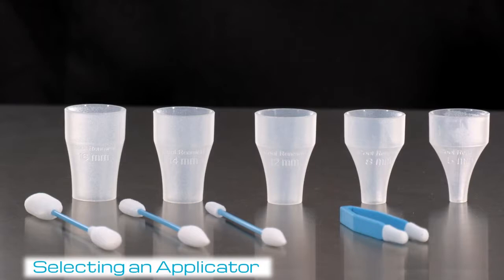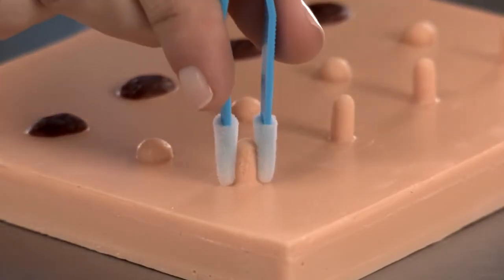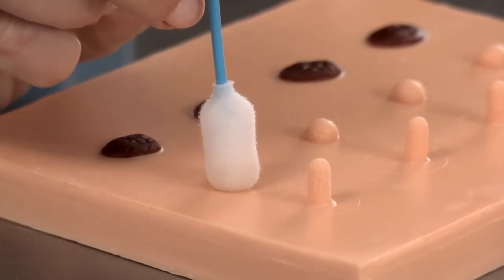Select an applicator based on the size and location of the lesion being treated. To ensure destruction of the entire lesion, the applicator chosen should be approximately 1 mm greater than the lesion.